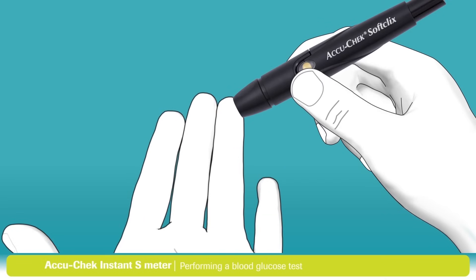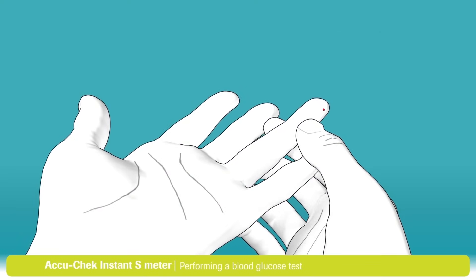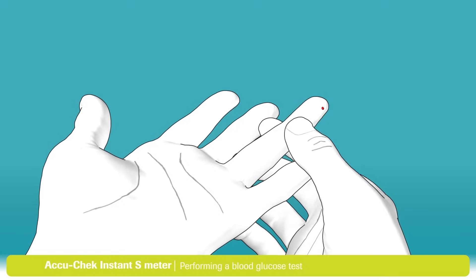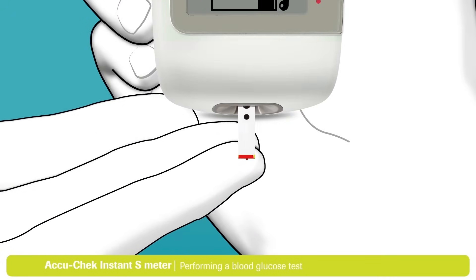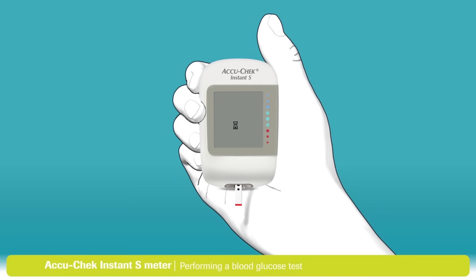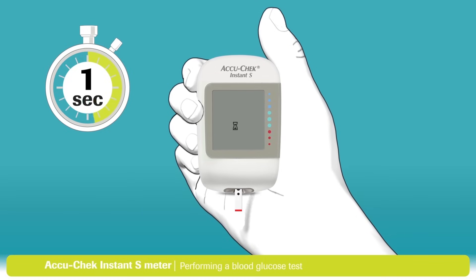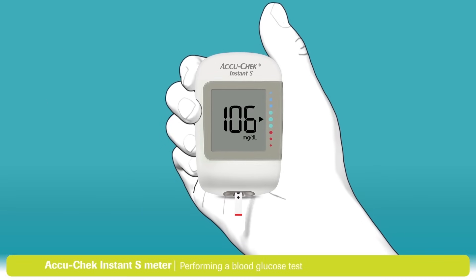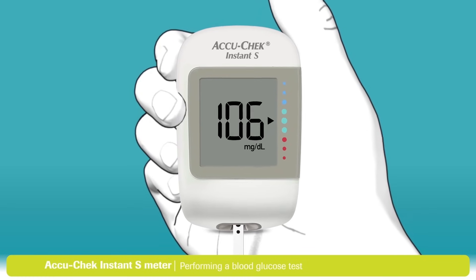Place the pinhole opening firmly against your finger and press the yellow release button to lance your finger. Massage the finger in the direction of the fingertip to help the blood drop form. Touch the yellow edge of the test strip to the blood drop — this wide area for dosing makes it easy to fill with just a tiny drop. When enough blood has filled the test strip, the flashing hourglass symbol appears and your blood glucose result will be ready in less than 4 seconds.